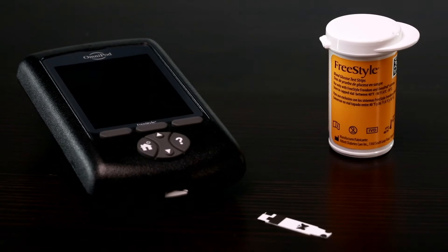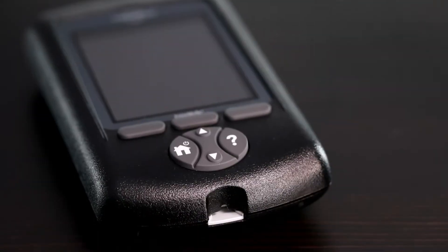Checking your blood glucose. You can use the built-in freestyle blood glucose meter to check your blood glucose levels as often as you need to.